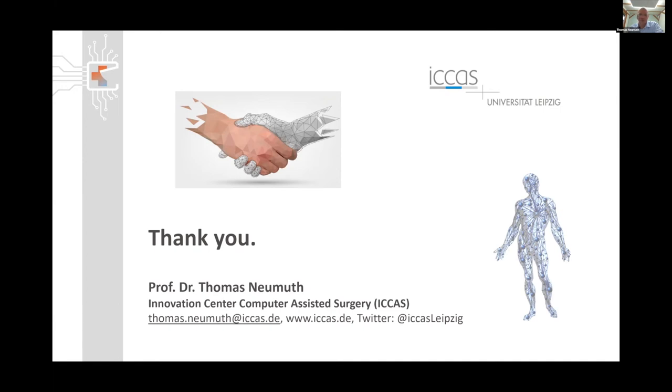And for the second question, the fallback for the operating room that follows the treatment steps of the surgeon: you can imagine this works like your car navigation system, for instance Google Maps. This system has sensor information about your position, it knows the way you want to go and your final destination, and it predicts and calculates everything on the road to the destination. If you decide, as an informed driver, to deviate from the road, to take a break at a petrol station or whatever, then the system follows you. It doesn't force you to stay on the road.